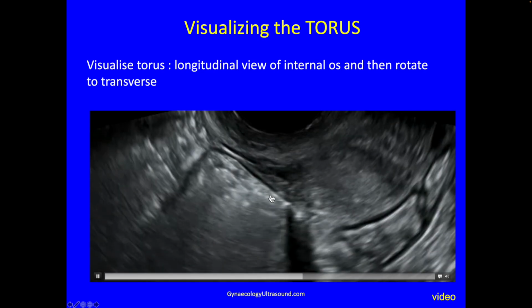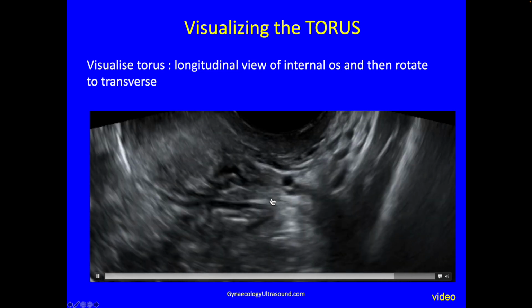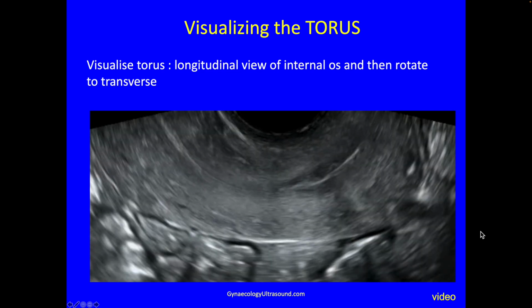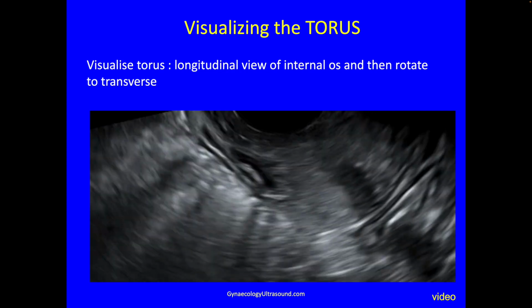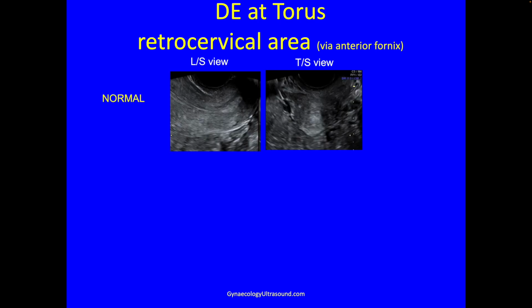And so the line this way, a little fine white line, is one uterosacral ligament, that's the other. And you can see they're very difficult to see. If they're normal, then they're very difficult to see. If they're not normal, it's not hard at all. So that's normal uterosacral ligaments. So normal looks like that in the longitudinal view and like that in the transverse view.